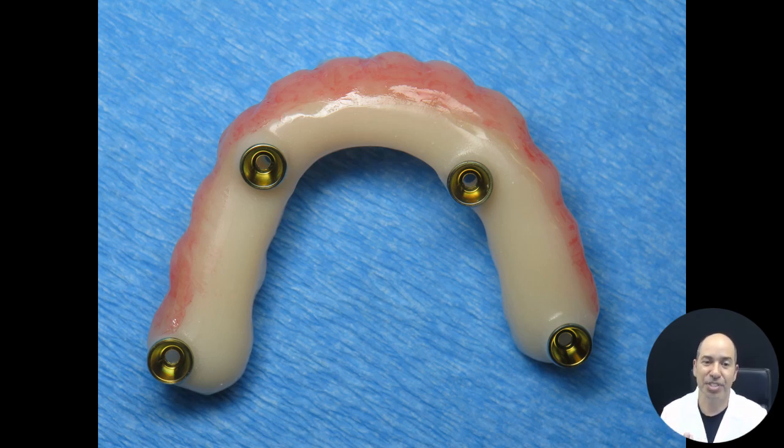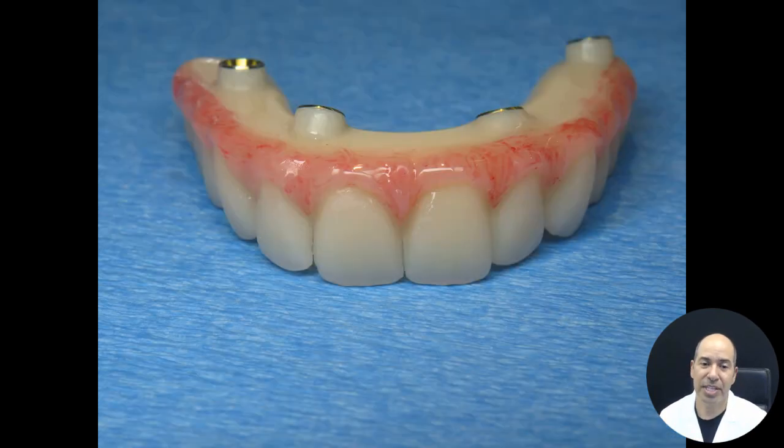This is the underside. You're like, where's the teeth? This is the underside, which is the most important part, that it's smooth, flat, convex. We call this the intaglio. This is what's going to determine the health of the teeth, longevity of the teeth, besides all the surgical planning that went in, implants in the right spot, proper leveling of the bone. I've got a lot of information on that as well.